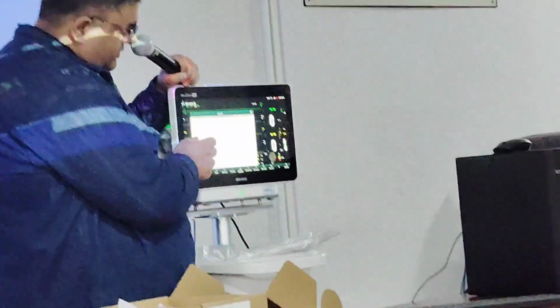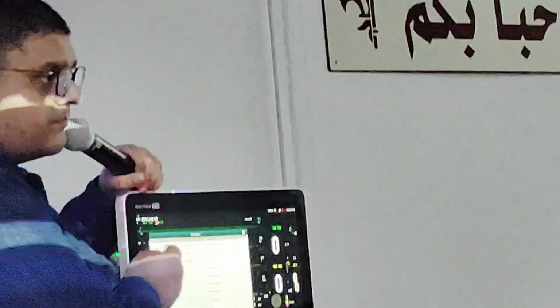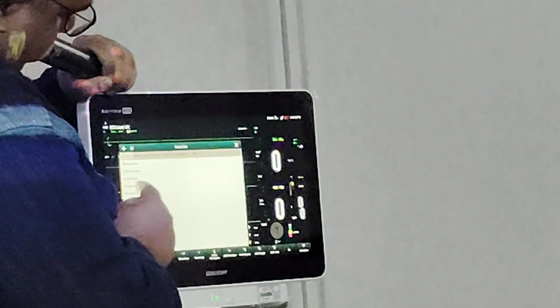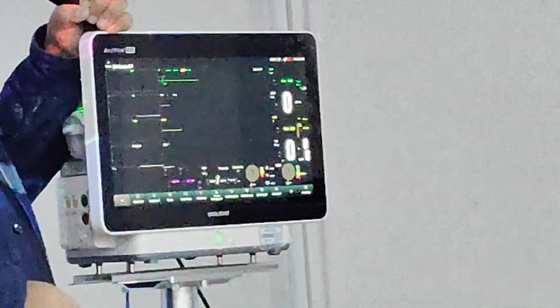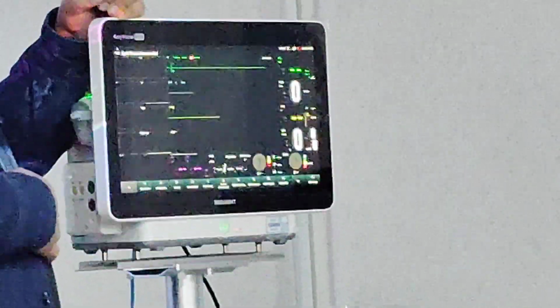In this display menu, the first one is called screen select. So I can go over here, and here I can choose the screen I want. For example, I want the dynamic trend screen. I'm going to click this one, close that, and we are in the dynamic trend screen. So I think this is how you would normally change the screen.